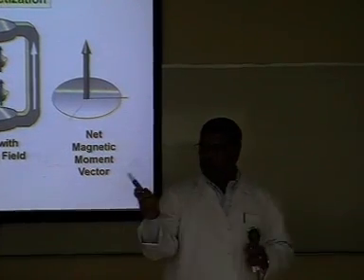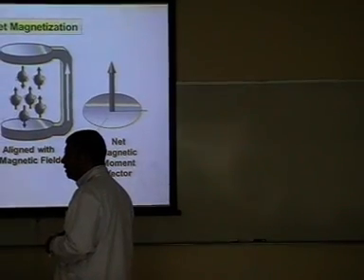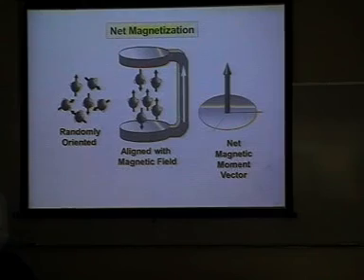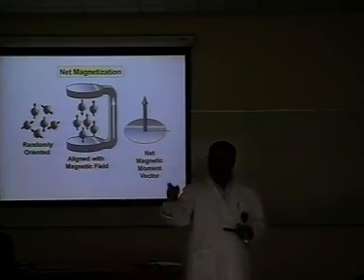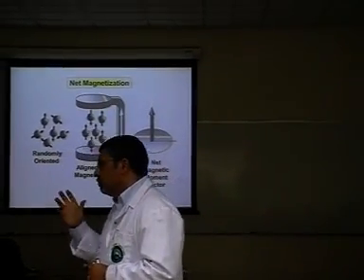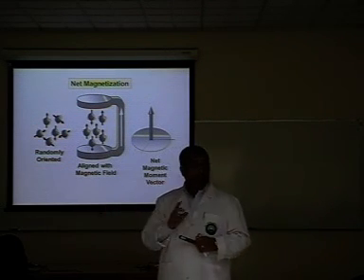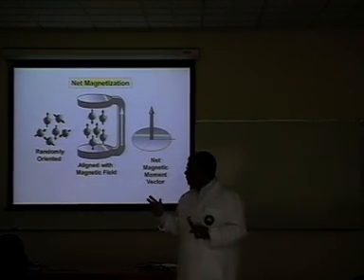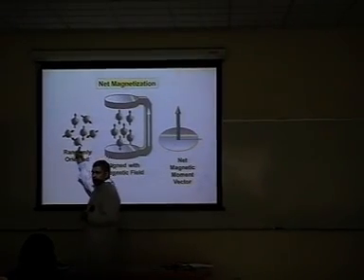Somebody? When we open the MRI, it will align. When you turn the magnetic field on, what happens? What aligns what? Yeah, but hydrogen atom, the proton. Yeah, proton. What's the proton look like? What did we model the proton as? We call it the magnetic moment, right? And what happened, and precession. Okay, so it's randomly precessing. You can see it here.